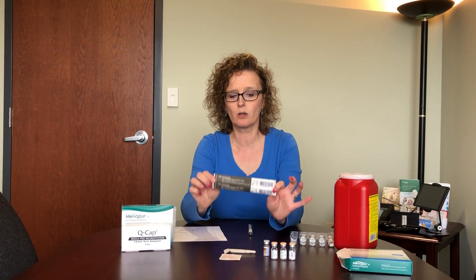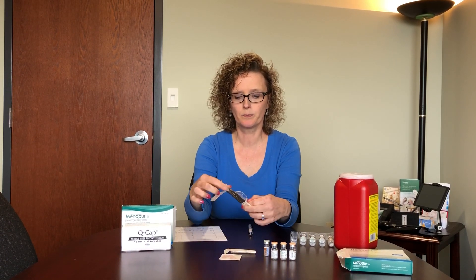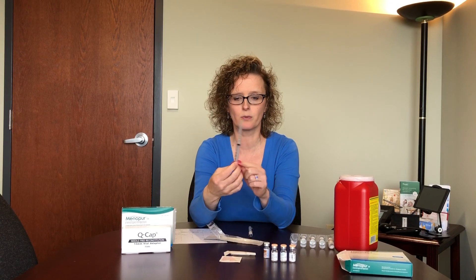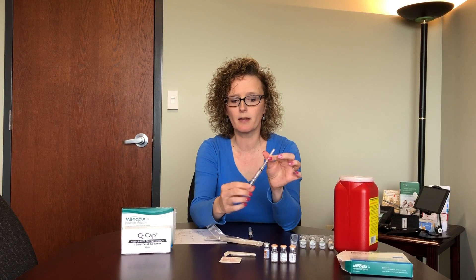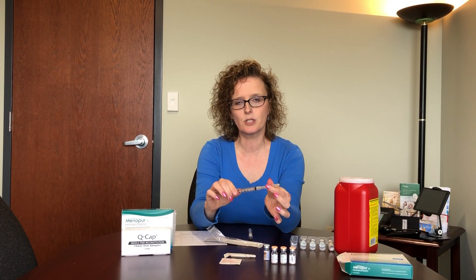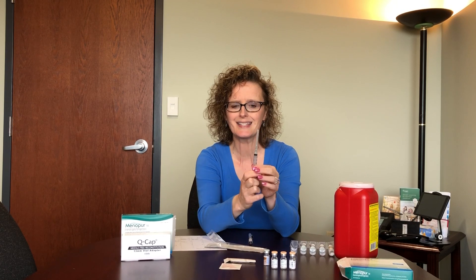Start with your mixing syringe — the package will just pull apart like so. You've got a nice syringe with three cc's and a big needle on it. Two things to do first: tighten the needle just a little bit, as they are packaged rather loosely, so make sure it's tightened down so it doesn't come apart while mixing. Also, these are packed with a little suction so they get stuck initially — if you pull down, you'll notice it pops a little bit, and then you'll have no problems with the syringe.